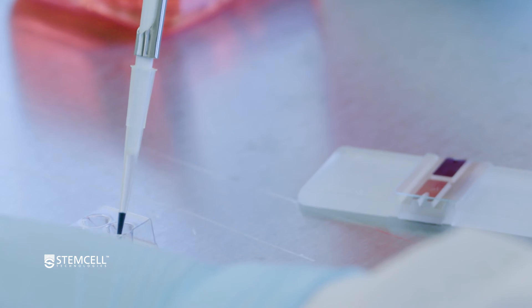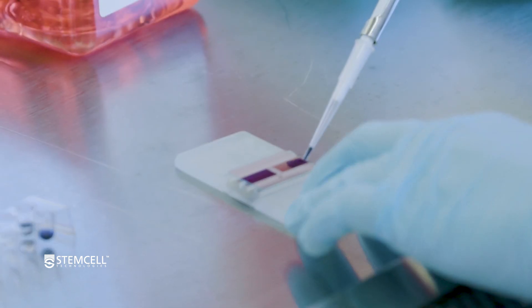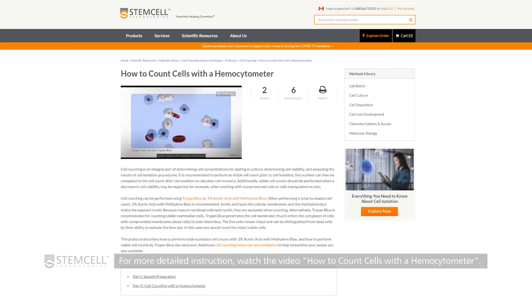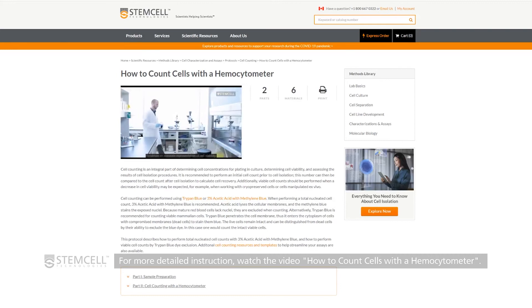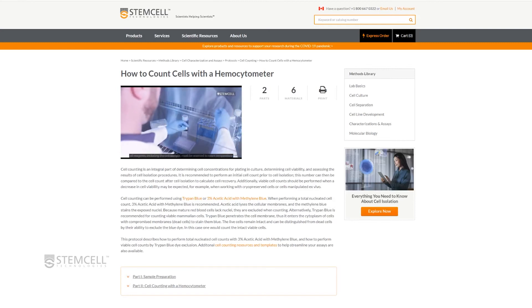While the cells are in the centrifuge, perform a cell and viability count on the diluted aliquot. For more detailed instruction on how to perform total nucleated cell and viable cell counts, please refer to our technical video, How to Perform Cell Counts with a Hemocytometer.